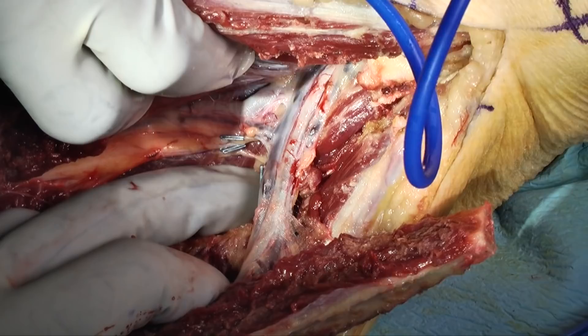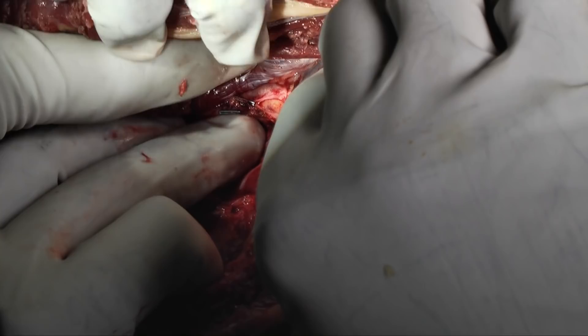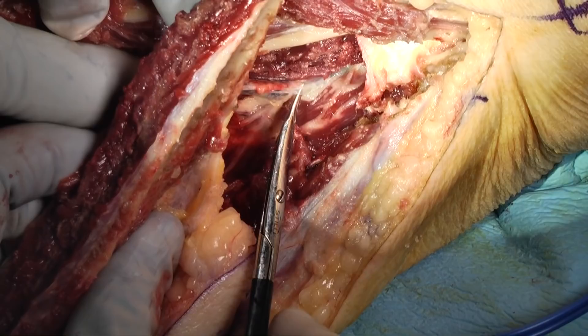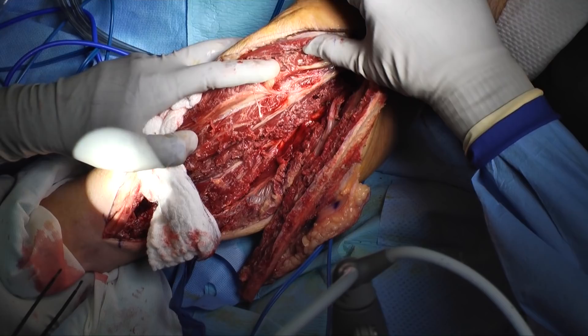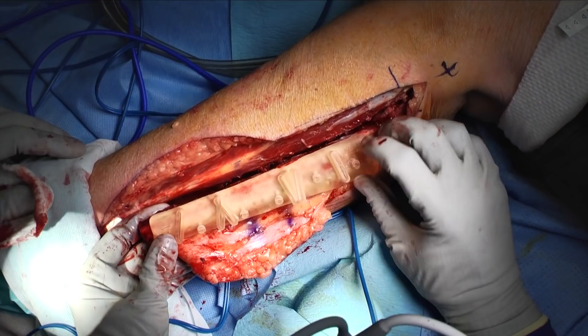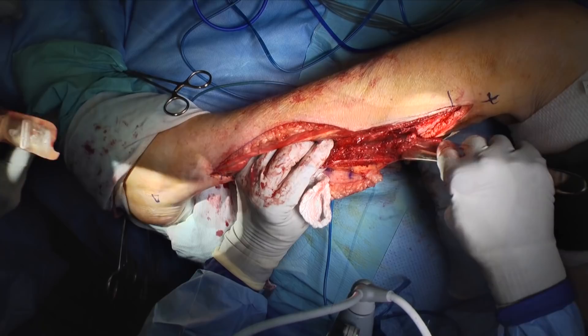Typically, we allow the flap to reperfuse for approximately 10 minutes. This allows elimination of some ischemic metabolic products in the fibula and allows time for small vasoconstricted vessels to vasodilate, at which point they can be recognized and controlled prior to cutting and insetting the flap. Care should be taken to ensure that the posterior tibial and anterior tibial vessels are patent. The vessels can be divided and the flap taken to the back table, or contouring can be performed in situ. The advantage of in-situ contouring is that you can ensure all segments have adequate vascularization while still in the leg.